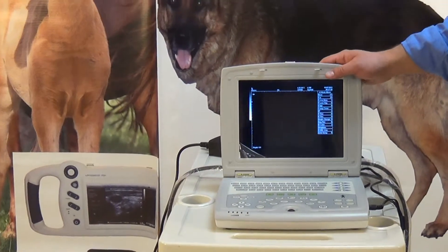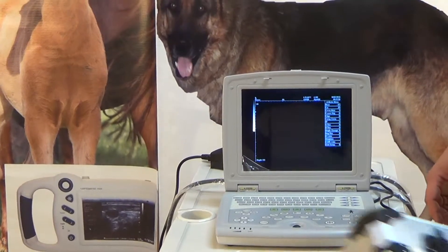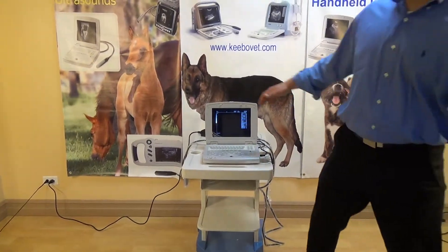It comes standard with two batteries, one probe, and an aluminum carrying case, which is actually pretty handy. I don't know if you can see it — it's pretty nice, because it's meant to be portable and used in the field. So protecting your machine is important.